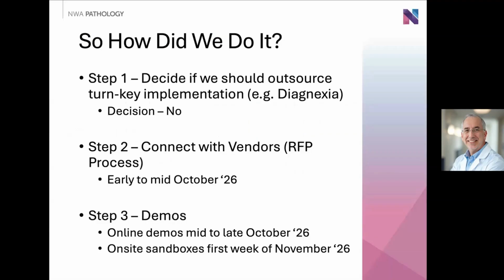Initially, we were not sure whether we wanted to outsource to a third party that could provide a platform for remote sign-out rather than fully committing to an in-house digital system. We found that this type of outsourcing was feasible, but relatively expensive.